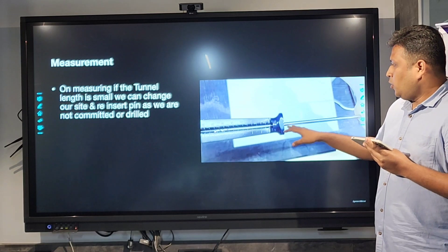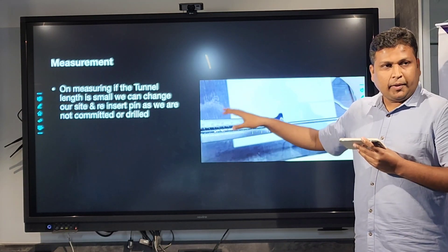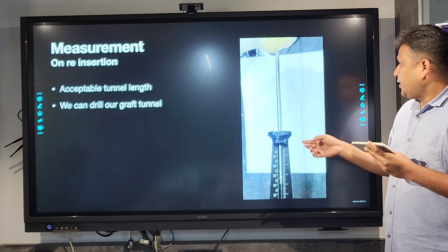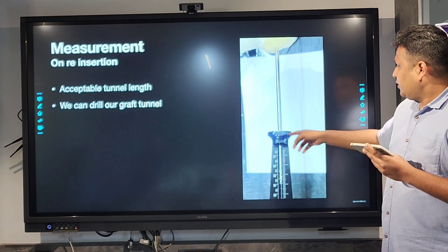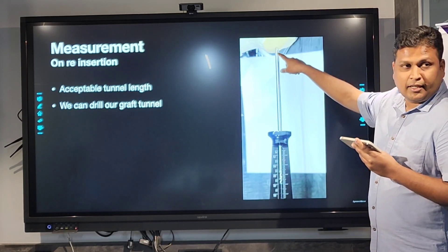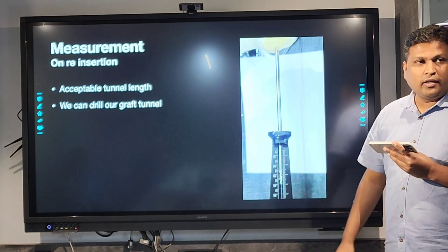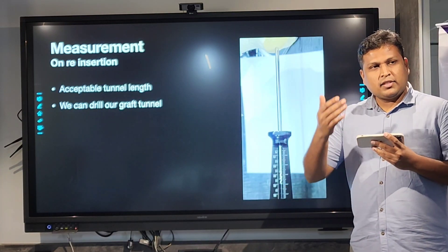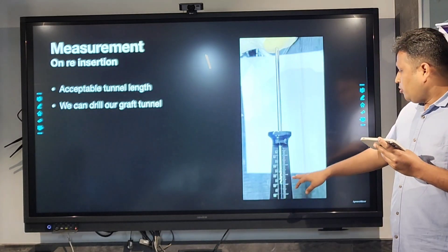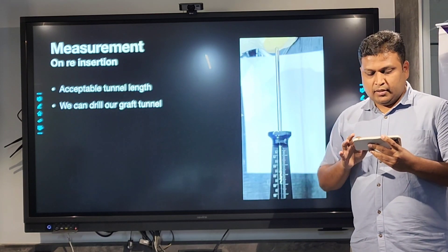To avoid this complication, the advantage of our guide is: if the measurement comes to 20, we cannot commit to that tunnel. We come out, reinsert from another side, and now the tunnel length is almost about 40, which is acceptable. Any tunnel less than 25–30 mm is not acceptable. Once we get 40, we can commit to the graft tunnel and proceed with drilling the ACL graft.